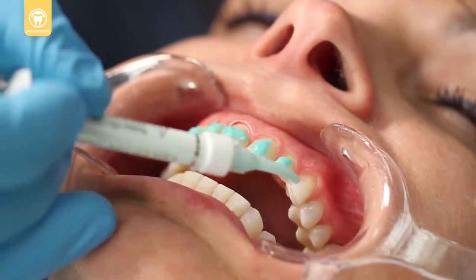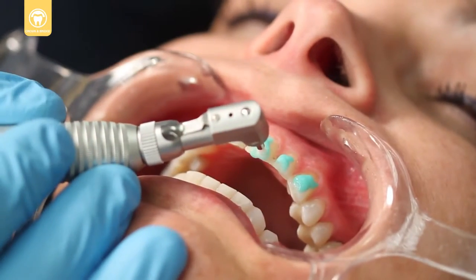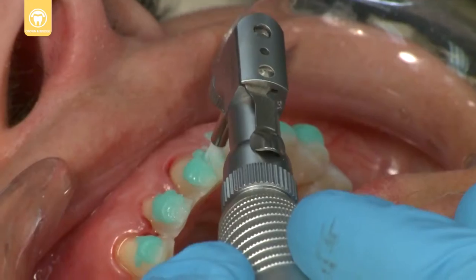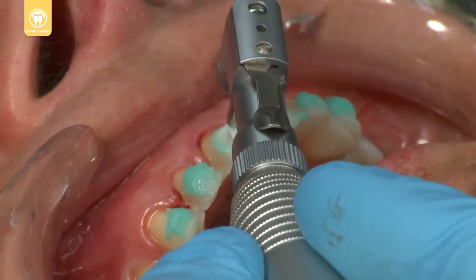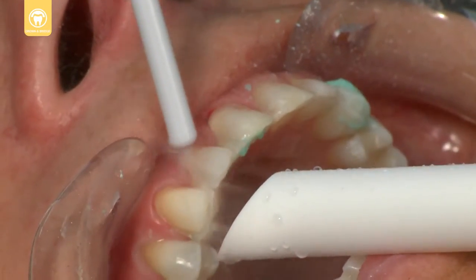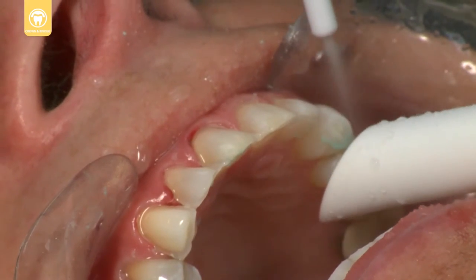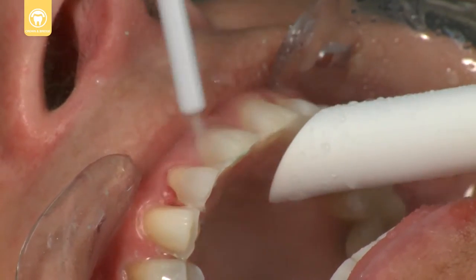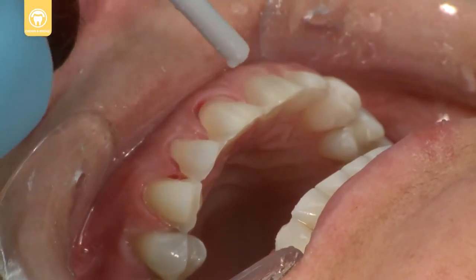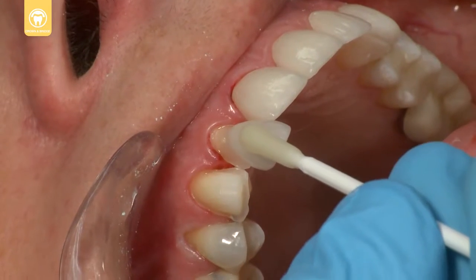Clean and disinfect the preparations with Consepsis scrub to remove residual temporary cement. Rinse and air dry the preparations, then verify the prosthetic fit.